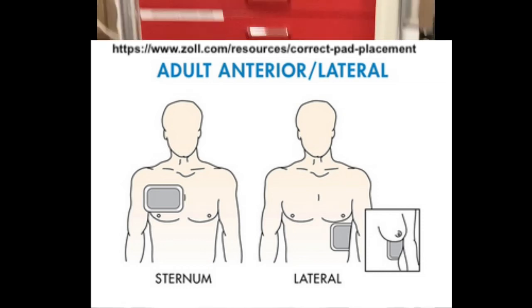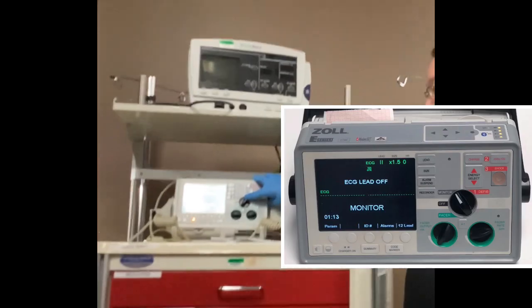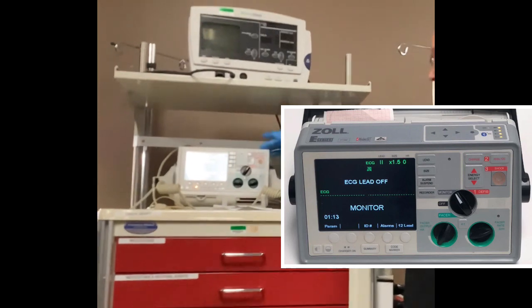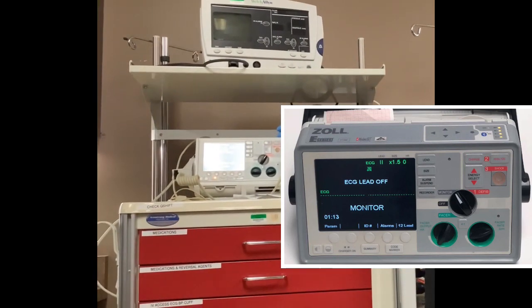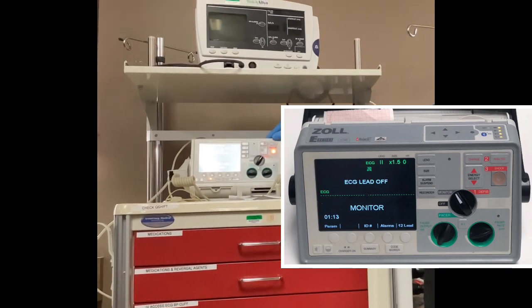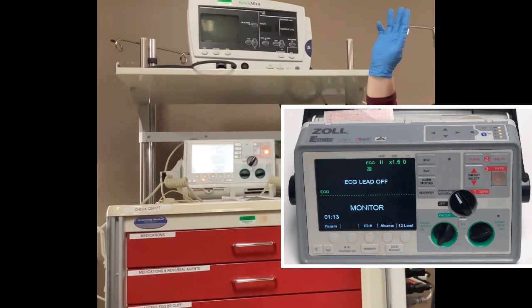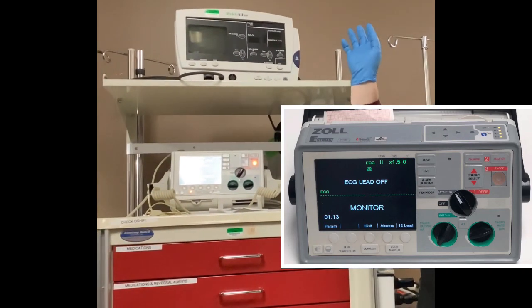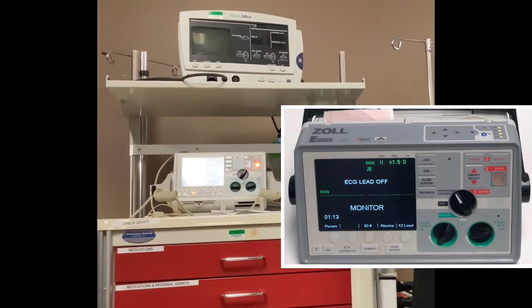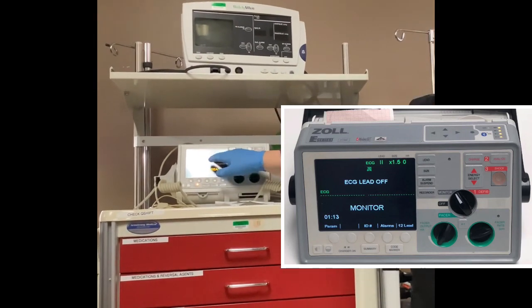You don't have to learn the whole machine right now, but defibbing is for patients in VFib or VTAC who don't have a pulse. We would increase our energy here, which for defib, for the record, is the whole thing. Then we would charge. Once it's charged up, what do you say? All clear. Yep, and no one put your hands up. Not like in class when we tried to defib me. It's super important to put your hands up. All clear, and then you would shock. Shock delivered.